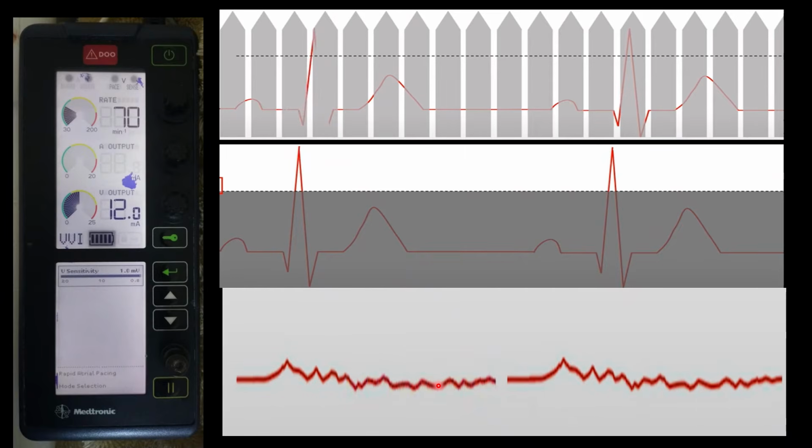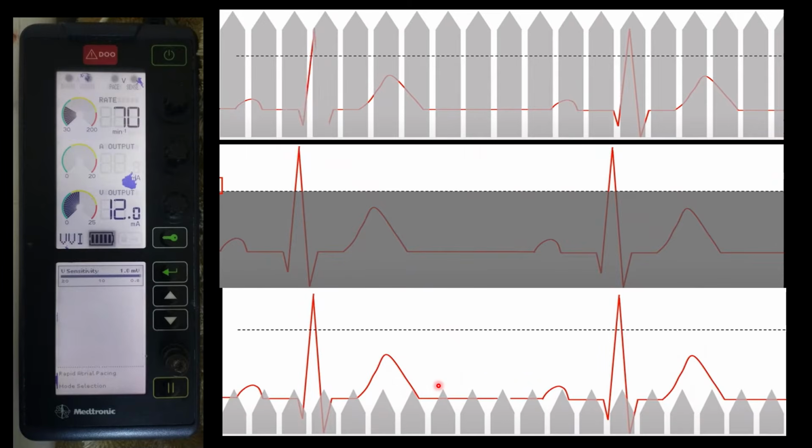And we should know that in a patient who has a unipolar temporary pacemaker, we should adjust the sensitivity to more than 5, as the pacemaker can sense the diaphragmatic contraction as electrical activity of the heart.